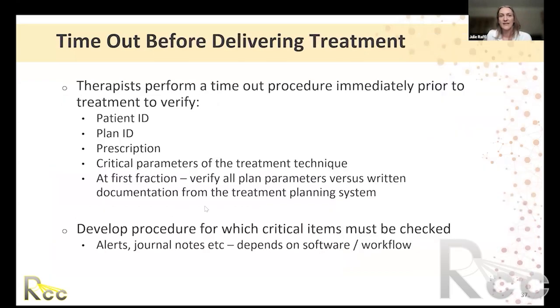So how this applies in radiation therapy: prior to delivering a radiation treatment, right before we turn the beam on, the therapist will time out to verify the patient ID, plan ID, prescription, and any critical parameters of the treatment technique. And definitely at the first fraction, you're going to want to have an expanded timeout where you're verifying all of the plan parameters versus the written documentation.